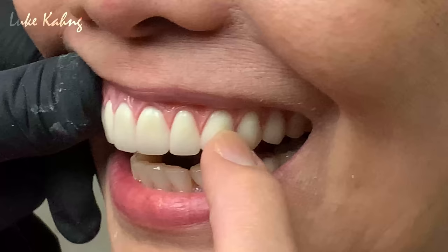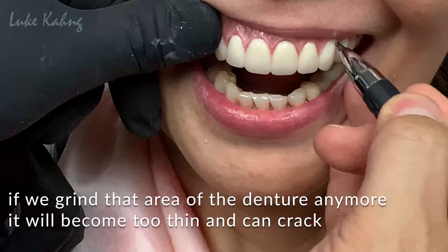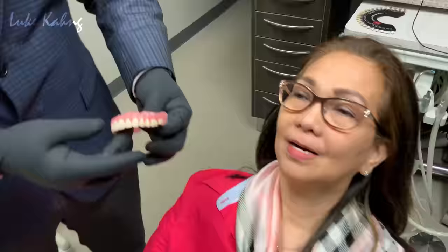Now, we don't recommend it. Otherwise, your denture is broken. Okay. You cannot make it flat. Okay. Maybe here, you mean? Can you see? All right, that's good. Let me grind it one more time. I'll be right there. So now he took it down, remember? It was beautiful. Ready?